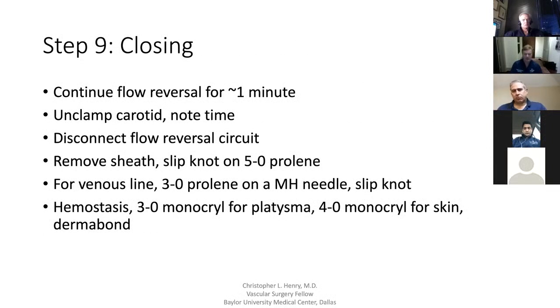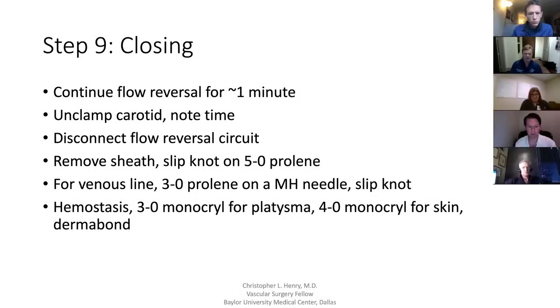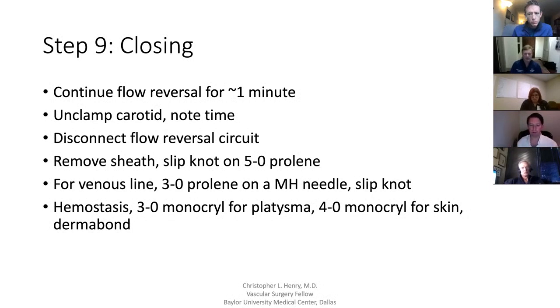Let the flow reversal run for about a minute, then unclamp the carotid and note that time, as it's one of the points they like to document. Then disconnect the flow reversal circuit. A nice technique is the slipknot on the 5-0 Prolene: do two throws the same way, then you can pull up on the string with the needle and pull the sheath out, then cinch up that slipknot, and hopefully you have hemostasis. Most of the time you do, but if not, you have that other needle and can place another stitch.